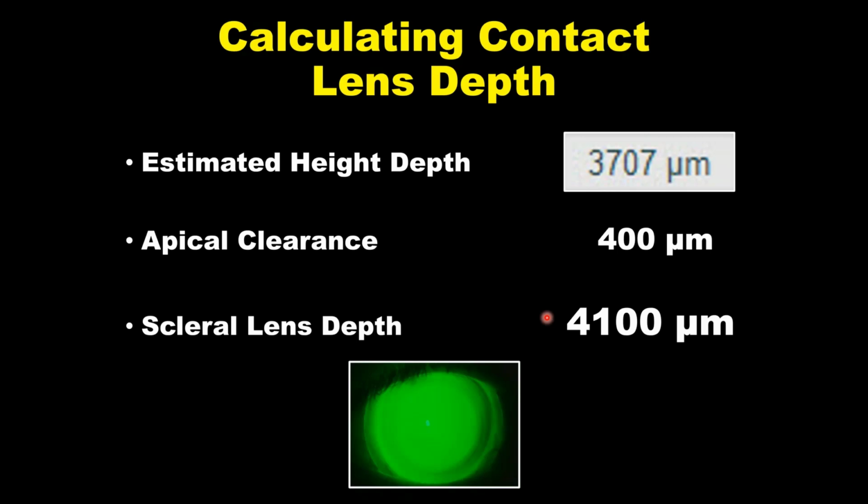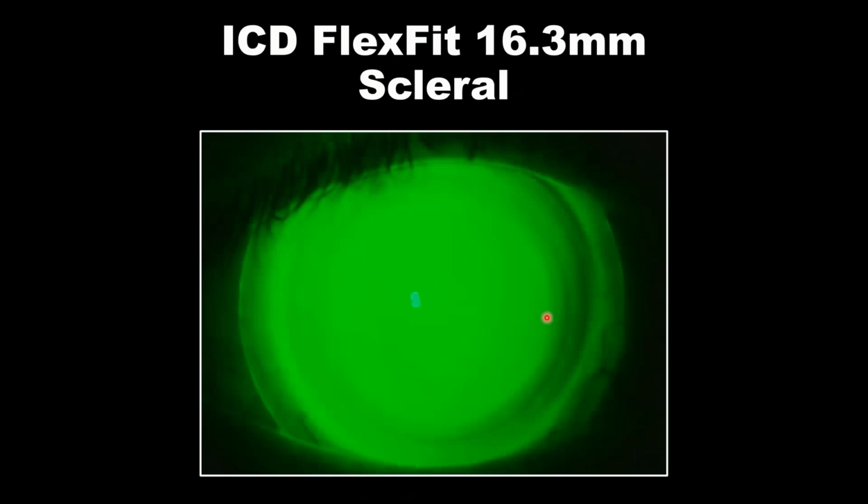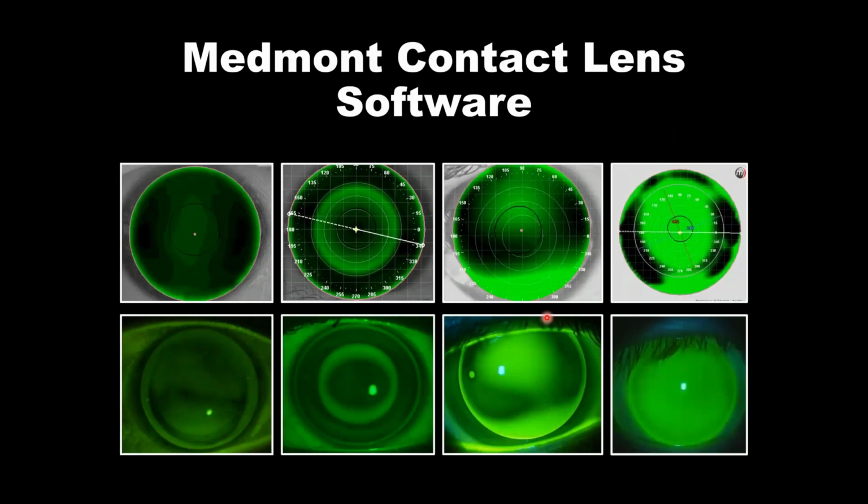So then we go to our diagnostic set and we place that contact lens on eye, and we hopefully have the ideal first lens. So this tool is used to help you design or to choose the initial scleral lens that you might pull out of your diagnostic set.